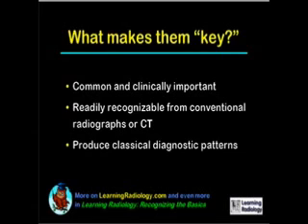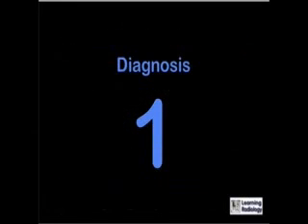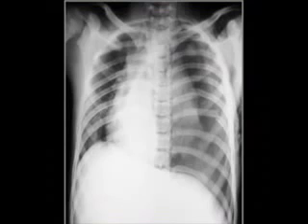There will be 15 included in this podcast and 15 in the next. And you can get more information on any of the material discussed on LearningRadiology.com, and even more material in the textbook Learning Radiology: Recognizing the Basics. This is Diagnosis 1. Why is this patient short of breath? And you can turn your computer or MP3 player off while you consider the answer.